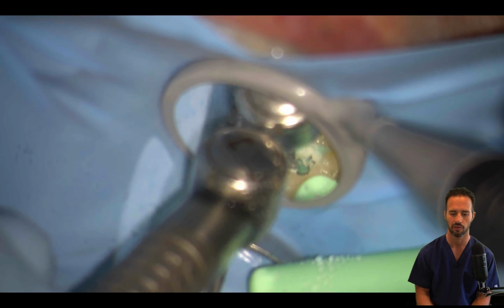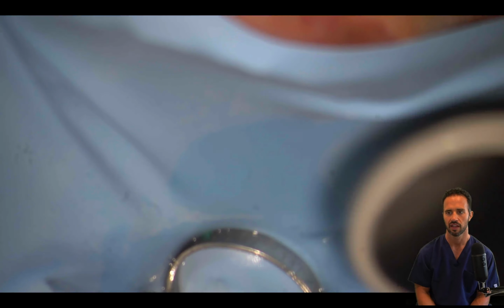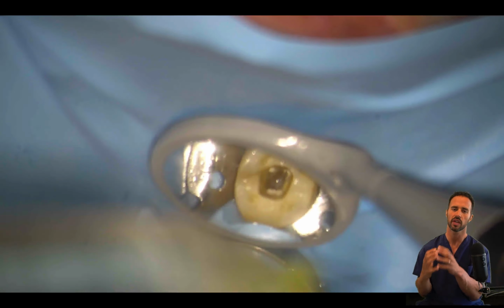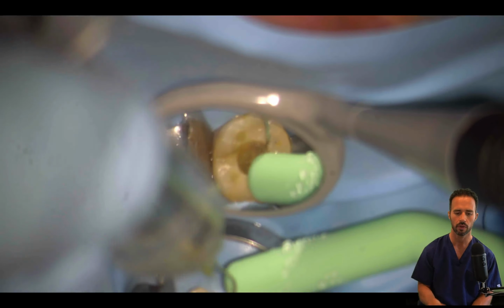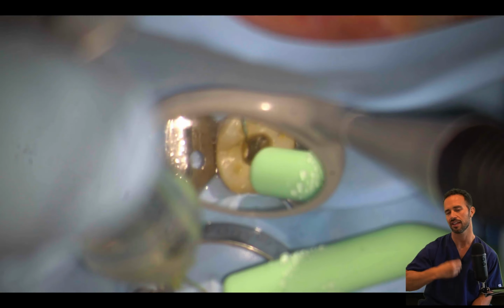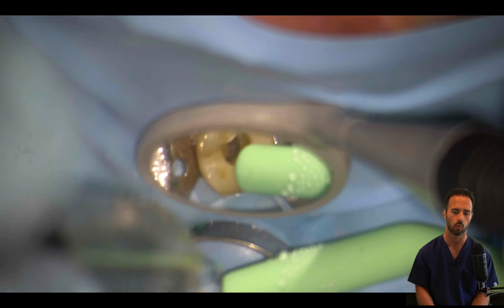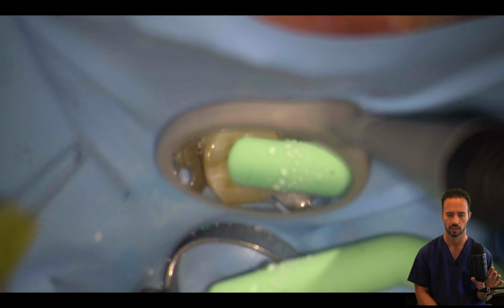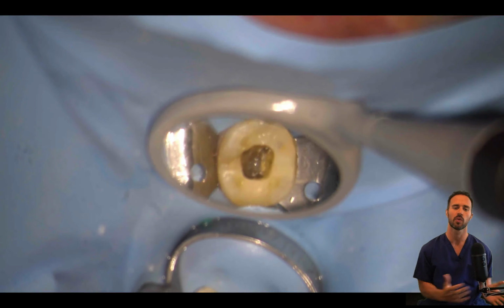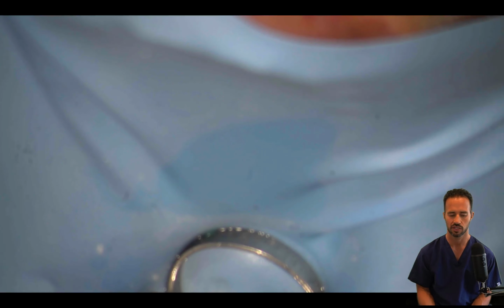But you might get a little of the sponge that gets whipped up in the bur. That's fine, but just make sure that you regain entry just as you left it last time. So we're going with our sodium hypochlorite, rinsing out a lot of that calcium hydroxide that was placed at the last appointment. You can see it's white there. It's that white creamy material. It's looking good, and we're pretty much right back to where we started at the last appointment.